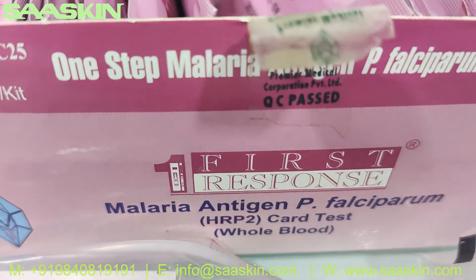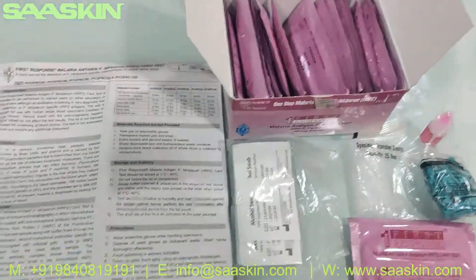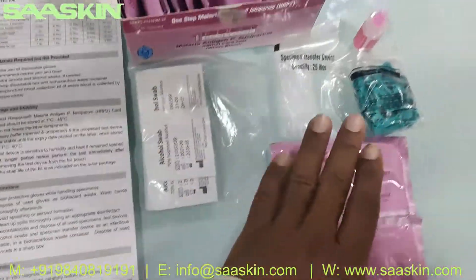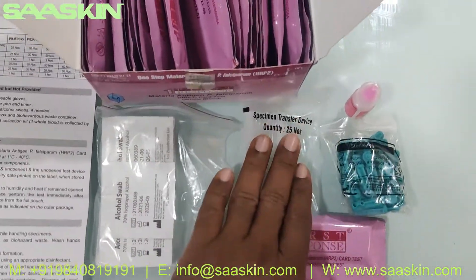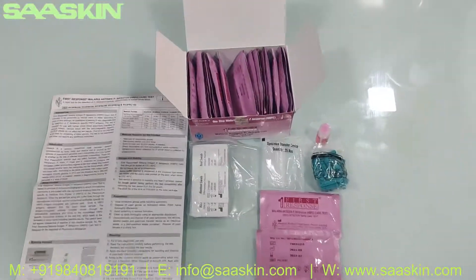This is a rapid card test for whole blood, and this is a 25-test kit box. Inside the kit you get an IFU brochure, 25 alcohol swabs, 25 sterile lancets, 25 specimen transfer devices, one buffer bottle, and 25 test cassettes. This is how the total test kit looks like.